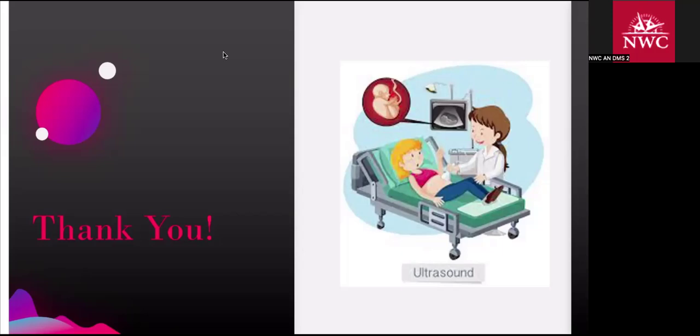It also says in that area about the ability of PACS to interface with other computer systems within the hospital. PACS doesn't confine you to just an ultrasound machine. You can use a computer to see your images, and the doctor can use their computer in their office to see the images. You don't have to be in one room. You can be anywhere in the hospital, and anybody can look at these pictures if they have access to PACS.